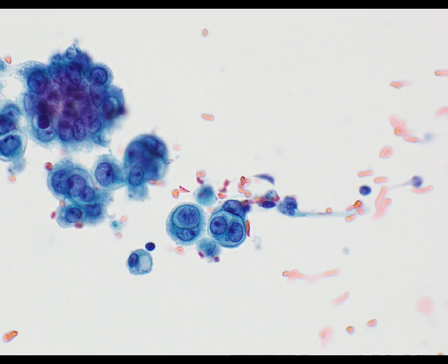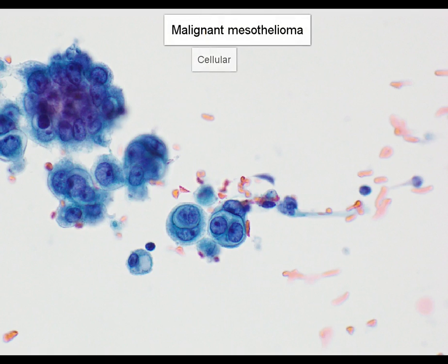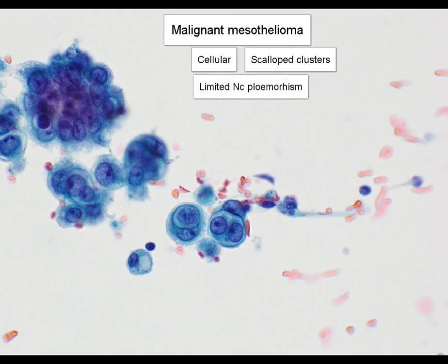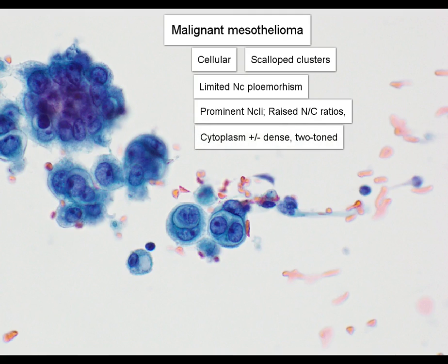So, in summary, we have seen some of the features of malignant mesothelioma. Usually the fluids are highly cellular. Cells are often arranged in cohesive clusters with scalloped borders. Occasionally they can be seen as dispersed cells. Often there is only mild to moderate nuclear pleomorphism. Nucleoli can be prominent, NC ratios can be raised, and cytoplasm is fairly dense and can preserve that two-tone cytoplasm characteristic of mesothelial cells.